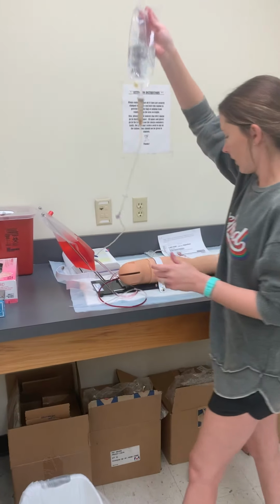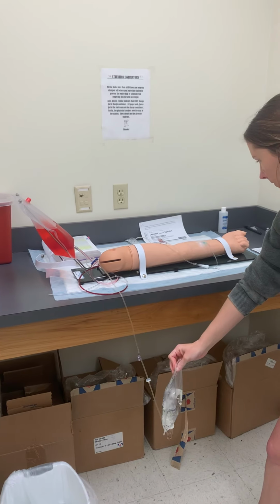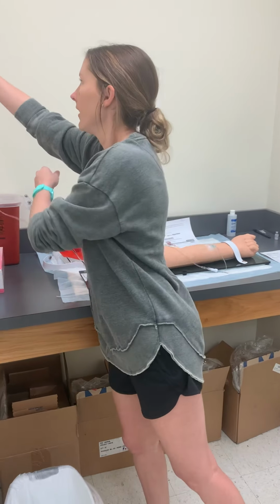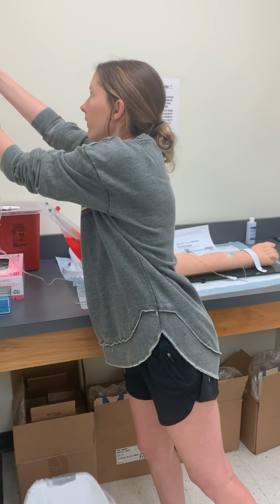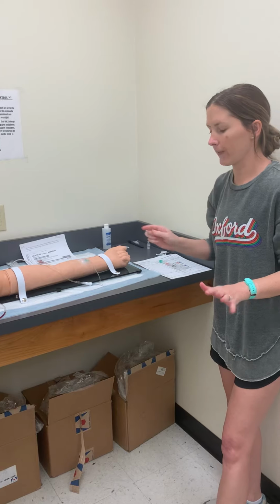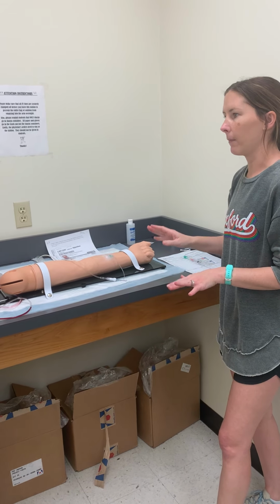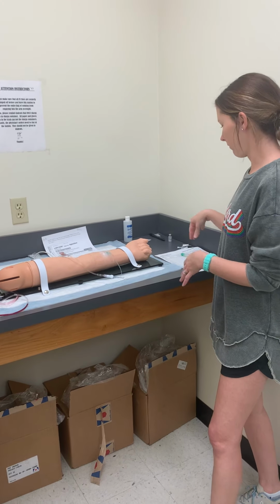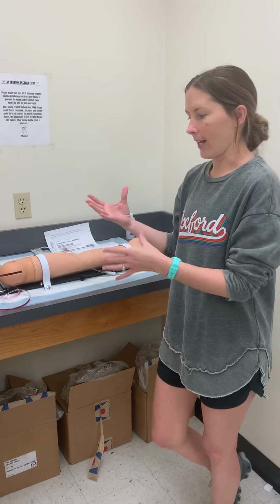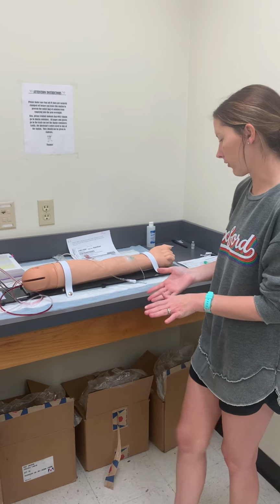Then I want to check and make sure I have a patent IV by lowering the bag. So I lowered the bag below the level of the arm, and if I have blood return, which I did, it is a patent IV. I also want to make sure, I'm not sure if I said this or not, to ask my patient if they have any allergies. Even though we read that on their chart and on the MAR, we want to ask them as well, just to restate that they do not have any allergies.